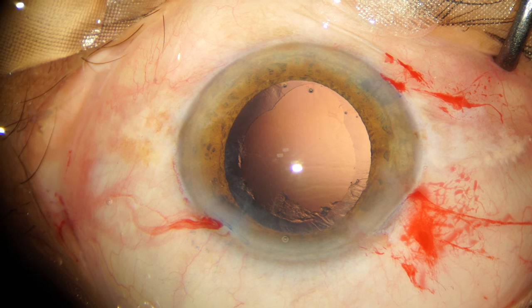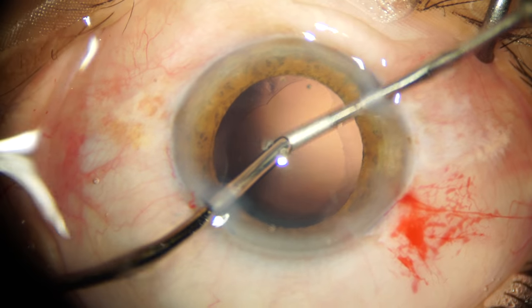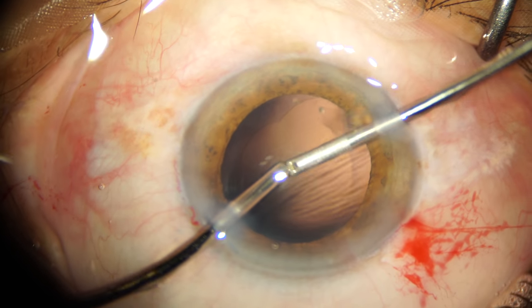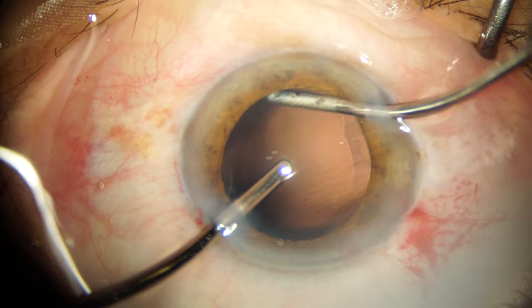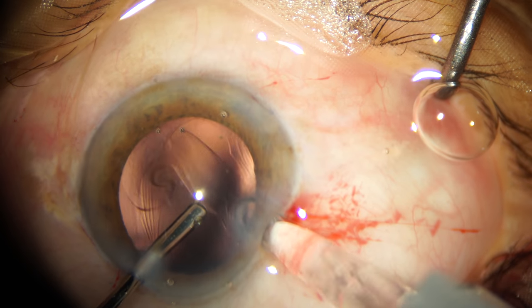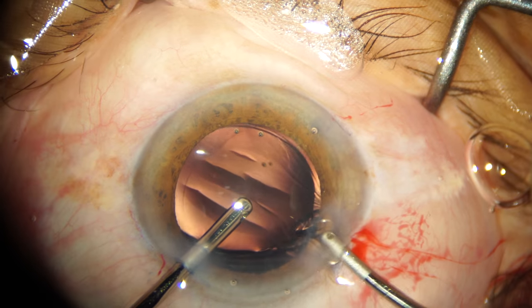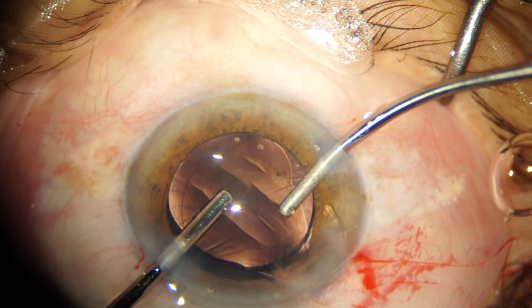Once phaco emulsification is complete, we go ahead and remove all the cortical matter with irrigation and aspiration. As you can see from the configuration of the anterior capsule rhexis margin, it looks like a snowman — we can call this a snowman rhexis. My preferred technique for IOL implantation is hydro-implantation, wherein the need for viscoelastic injection in the anterior chamber is non-essential, reducing one potential source of toxic anterior segment syndrome.